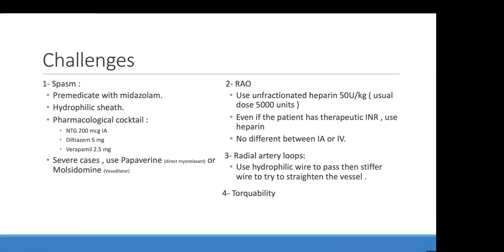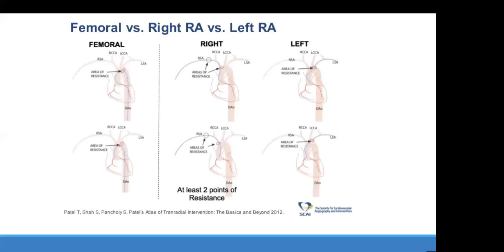Okay, torqueability. It's challenging, although it's not as much an issue for you guys, because most of you will be trained in a radial environment, so your learning curve will be higher. It was mainly an issue for senior interventionalists. They don't know how to do radials because, as they say, you can't teach an old dog new tricks. At some point of your life, learning a new technique may not be cost effective because it's a new skill and a new method that you're not comfortable with.